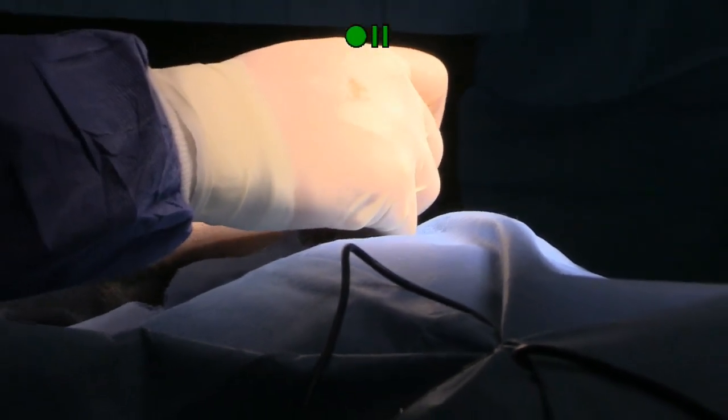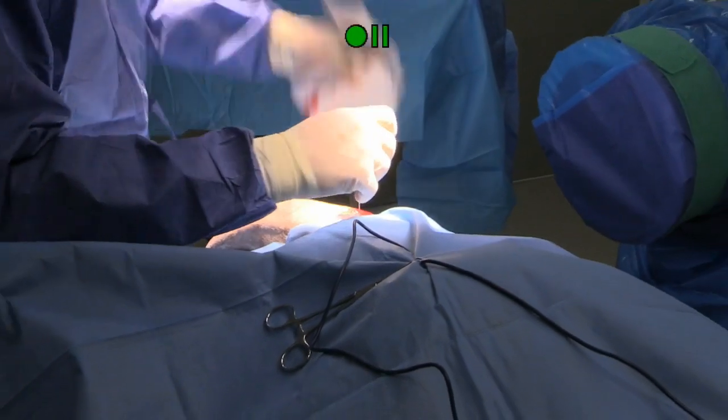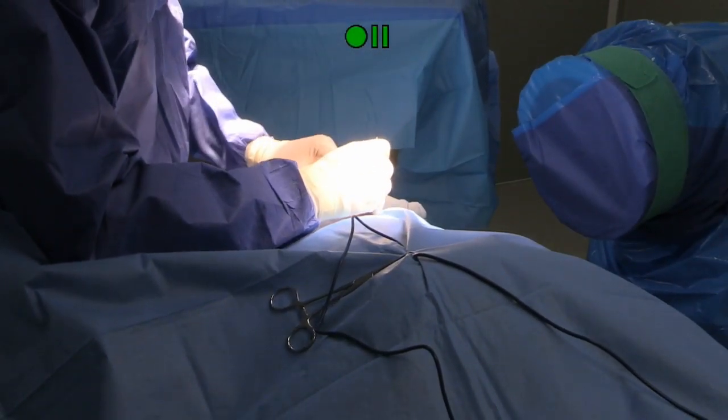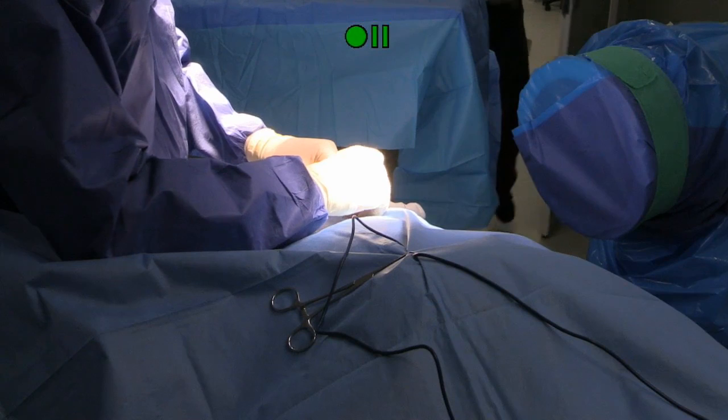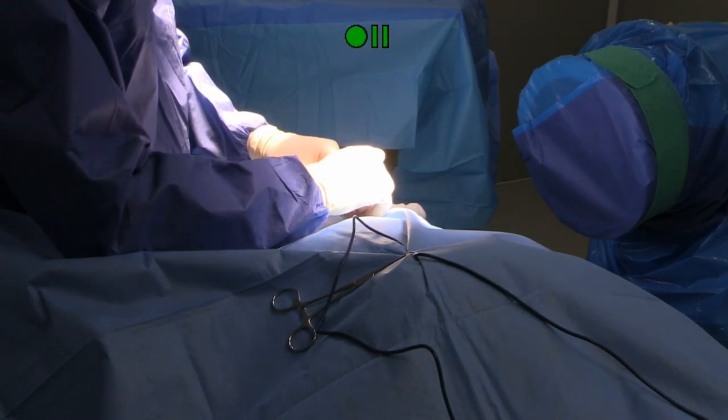So we're using a cannulated 3.5 drill bit, but what am I actually going to do? Drop my pin down there. So the nice thing about the cannulated drill bits is that they go over the pins, but sometimes they end up pulling your pin out of the hole that you wanted to create.